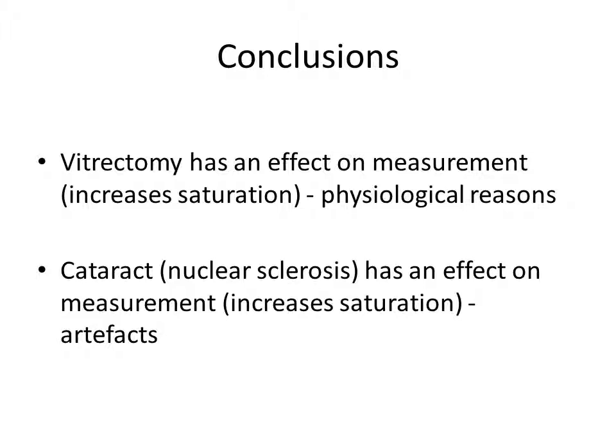So this needs to be kept in mind, and I think that for investigating other diagnoses, this needs to be an exclusion criterion. And the cataract has an effect of increased saturation, but in this case it looks like it's an artifact, and again it needs to be kept in mind for future studies.